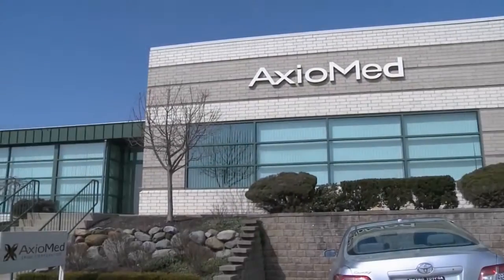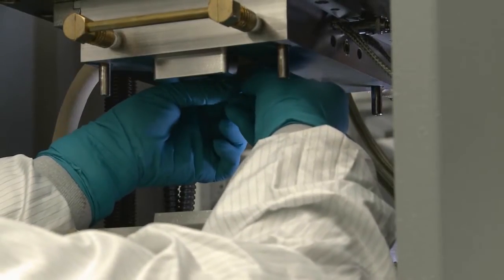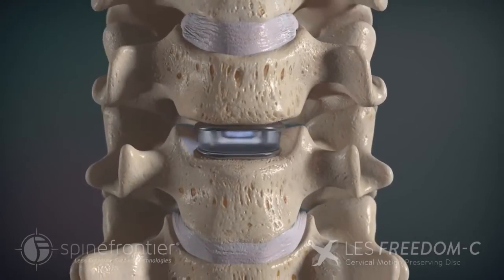When you look at the Axiomad store, both engineers and surgeon champions who followed in Art Steffi's footsteps when he developed the Acroflex disc — when you look at this disc, with the polyurethane combined with the titanium end plates, you now have a disc that truly mimics the human disc.